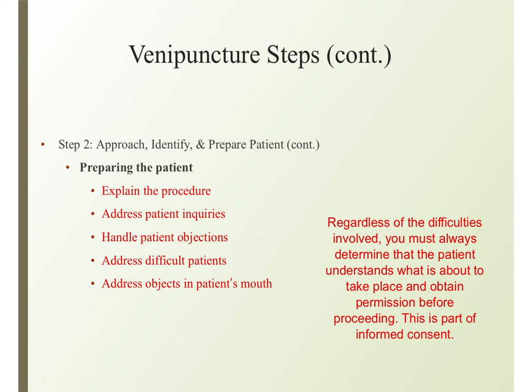So this right here is just a technical question, okay? This is talking about gum and candy in the patient's mouth. It is said that they should not have it in there. I don't enforce this one completely, but if they have problems having their blood drawn, you can ask them to take it out because we don't want them to pass out with gum or candy in their mouth. Okay. Again, that's a little bit of a gray area because, to be honest, I don't address that with every single person. Okay. But that is the standard.